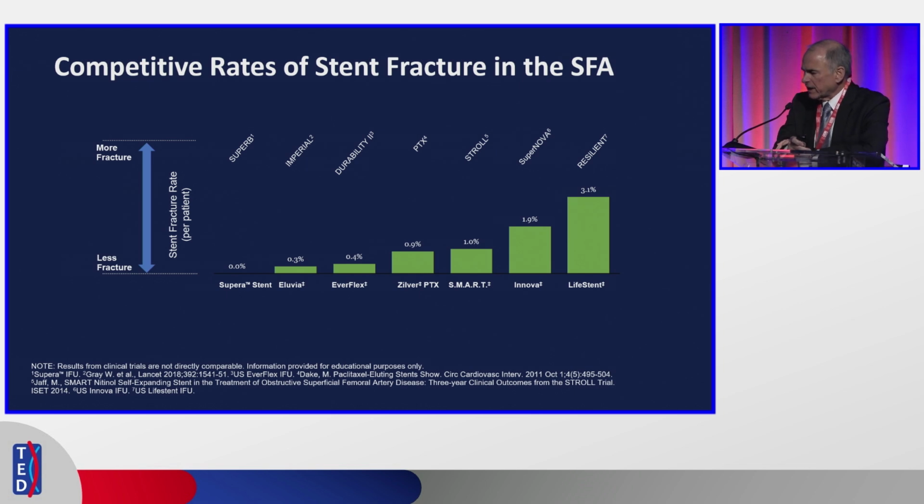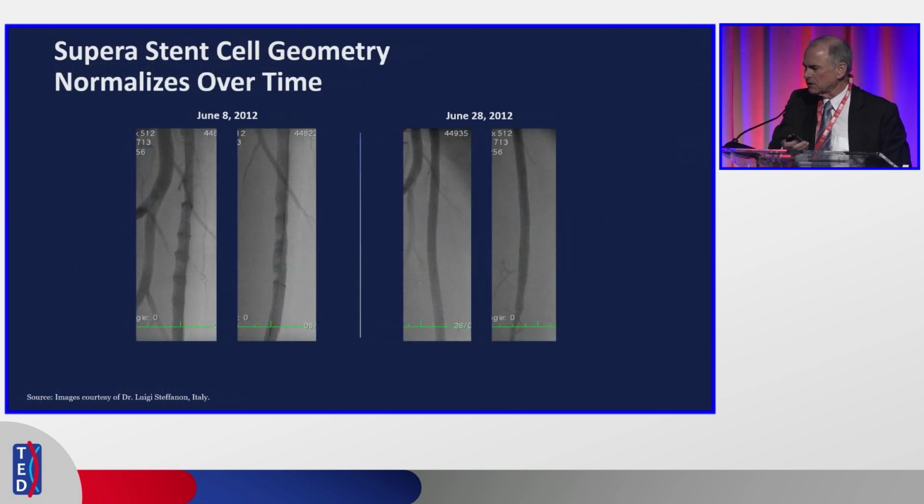Now, what about stent fractures? These simply don't fracture. I have been sent cases where fractures did occur, and I've seen them in 3 cases. 2 of those were where people had placed them in popliteal entrapment syndrome and had tried to go in after and open them up with cutting atherectomy, and who knows which caused the fracture. And I saw one other, I don't remember what happened, but there were multiple atherectomies performed. People would send me these as they saw them.